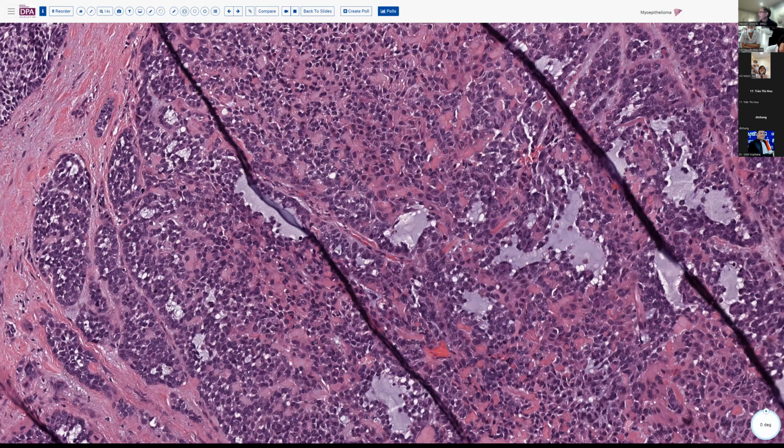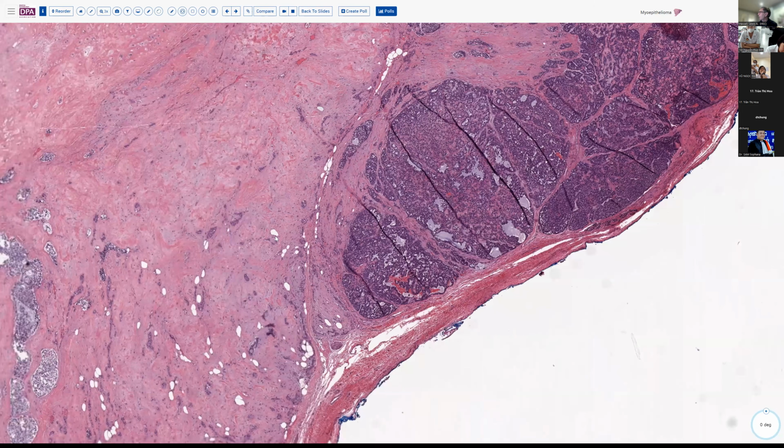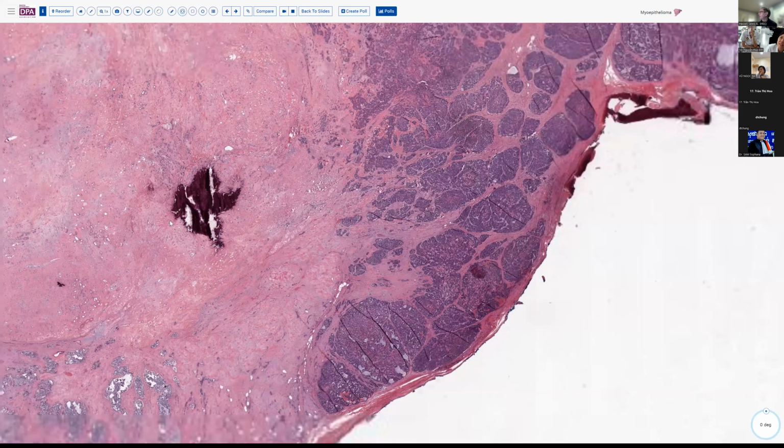So in this sort of a situation, if this was all staining as myoepithelial cells and I didn't see very much of the epithelial component remaining here in this obviously very hyalinized precursor lesion next door, I might say a myoepithelioma arising from or associated with an old pleomorphic adenoma, depending on the amount of epithelium that I characterized in this area here.